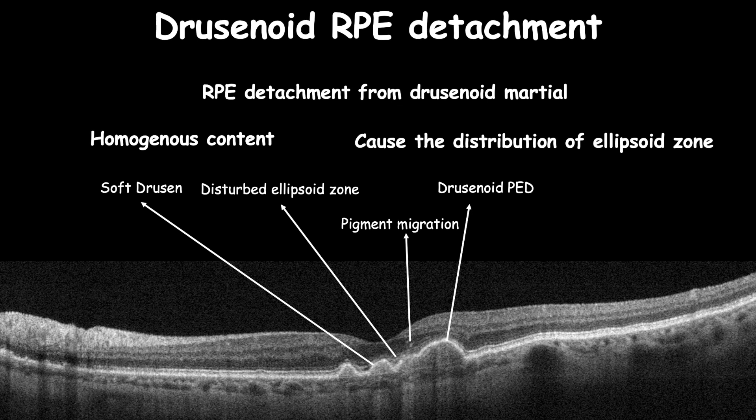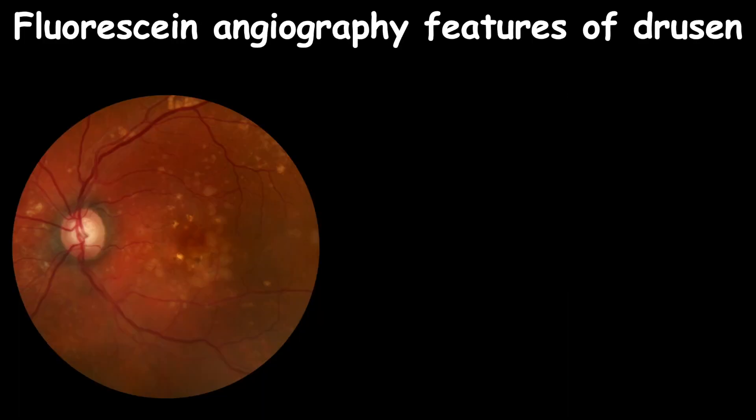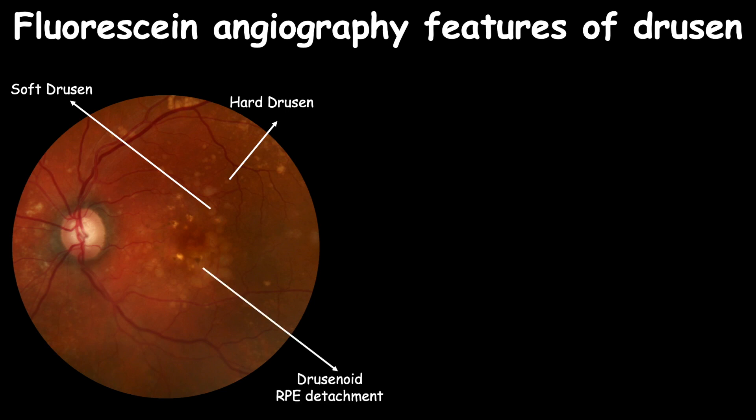Drusen can differ in location — they can be located in the optic disc, forming optic disc drusen, at the macula, or in the periphery. This case contains hard drusen, soft drusen, drusenoid RPE detachment, and intraretinal pigmentation.